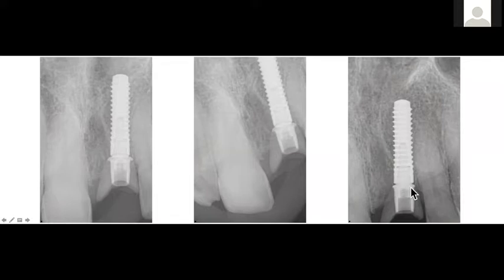The new Straumann tie bases, or Vario Bases for CEREC, are going to be called Vario Base C, which will hopefully be FDA approved soon. They will have a much narrower platform to where they come up higher, so you don't need to do this manual reduction anymore. But you should try to get this away from here as much as possible, by at least 0.5 millimeter, as shown here in this specific situation.